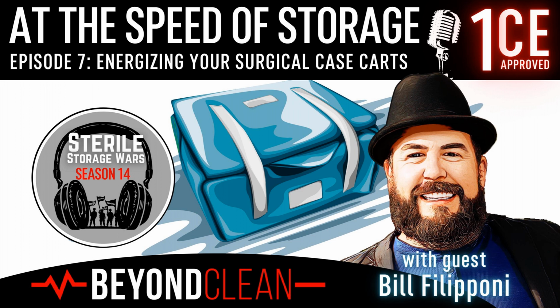Yeah. So when we look at case carts, let's look at two different types: you have a closed case cart system and you have an open case cart with maybe a wire rack. When you look at a wire rack, you're going to need some type of cover. You're going to need some type of solid bottom shelf on that case cart. I think people sometimes get confused when you look at wire racks and they say, well, we don't need that solid shelf on the bottom or a cover. Depending on how far you're going, you still need to have a cover and that solid shelf on the bottom. But nobody wants to invest tons of dollars in just a cart that moves their supplies. So it's important to make sure that you research and find the right open cart for your purpose.